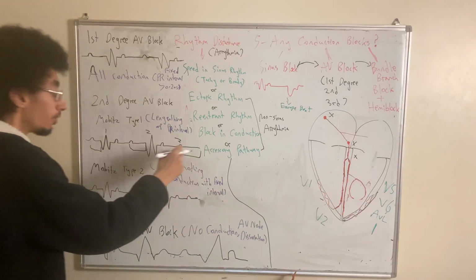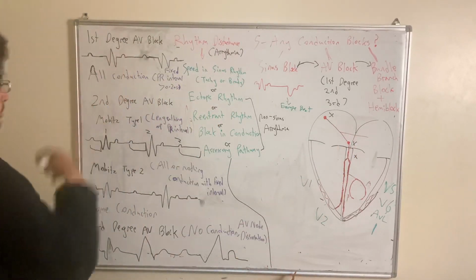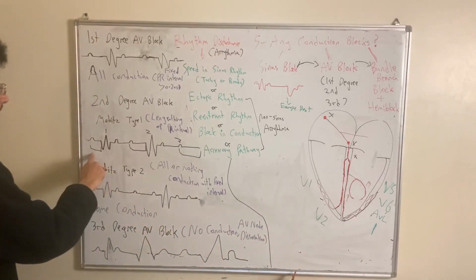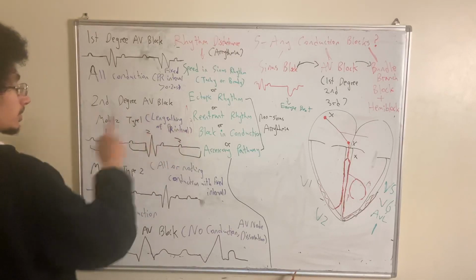Where's the QRS? Where's the T wave? I'll tell you what happened. Because of a block in the AV node further than the first degree, that basically means that further and further block will cause further and further prolongation of the PR interval with every beat, to the point that the next beat will show what is known as a drop beat.